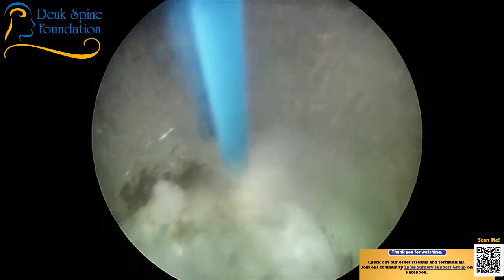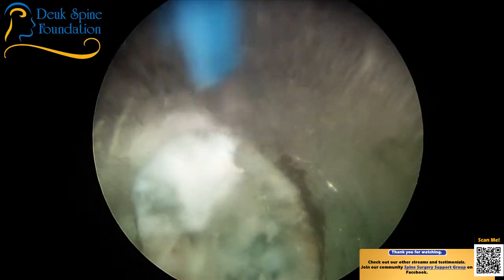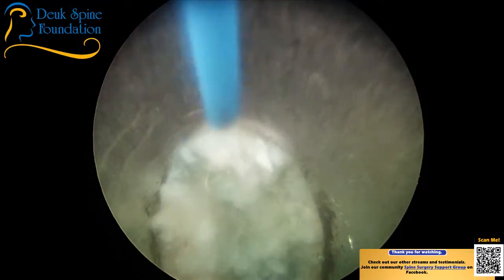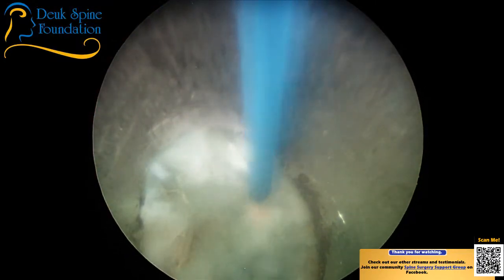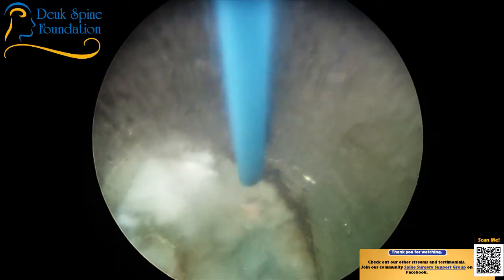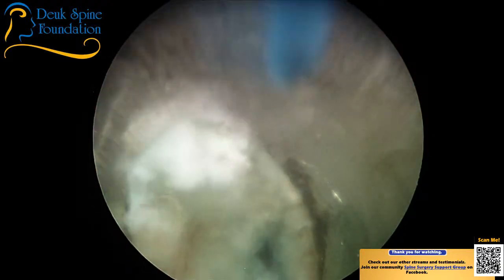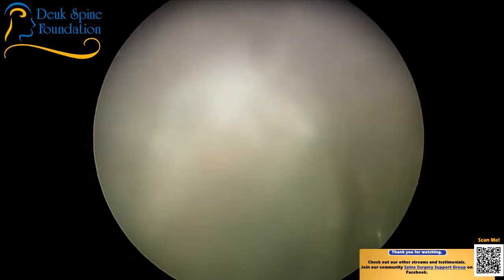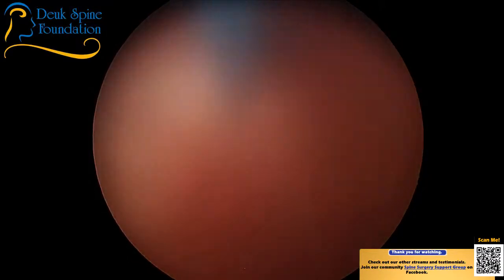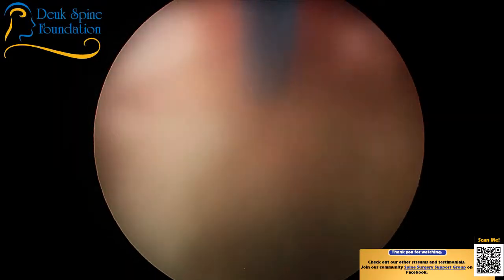So, long story short, this patient doesn't need a scoliosis surgery to get rid of her back pain. She'll still have scoliosis. The scoliosis is relatively stable, okay? It's not unstable scoliosis. It's called glacial instability, meaning that it shifts over time, over many, many years, like a glacier moving down a valley. That's just a little bit of bleeding from the bone, from a bone spur that I just zapped.